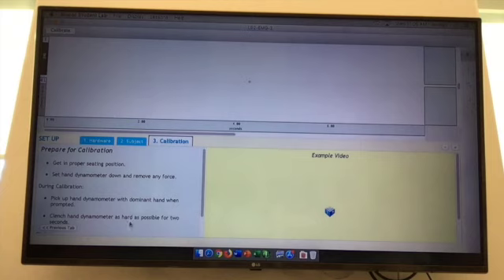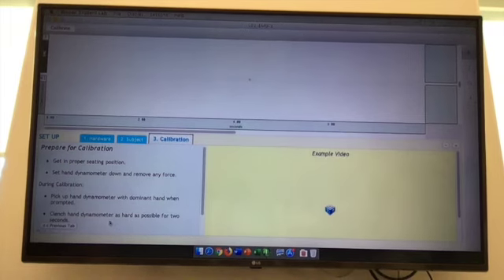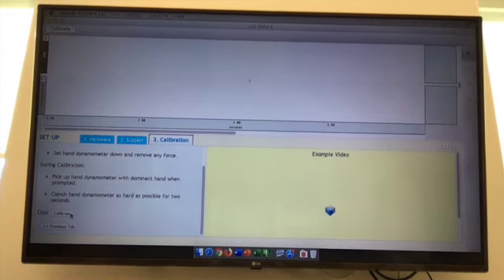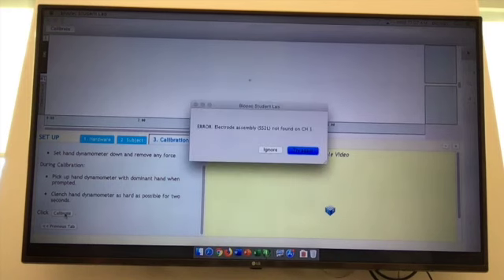All right, so we have our subject already in a seated position, and we have gel on their arm with the electrodes, so we can get a good electrical signal coming through. We are going to have them clench the dynamometer with their dominant hand as hard as possible for 2 seconds, just to calibrate the system.